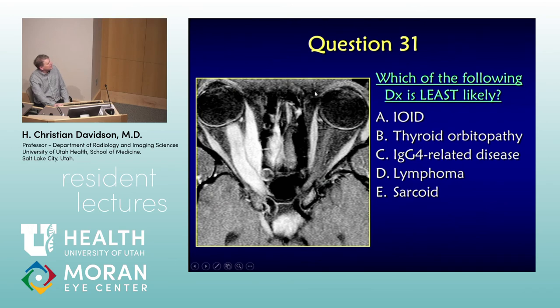Okay, T1 post-contrast, and this patient has lots of abnormalities. They have the muscle involved, they have optic nerve involved, and if you look closely, they even have intracranial disease. They've got a mass in the suprasellar region, and there's even some linear enhancement right along. What normally runs right there? That's third nerve. So you've got somebody with lots and lots of multifocal, pretty extreme enhancement.